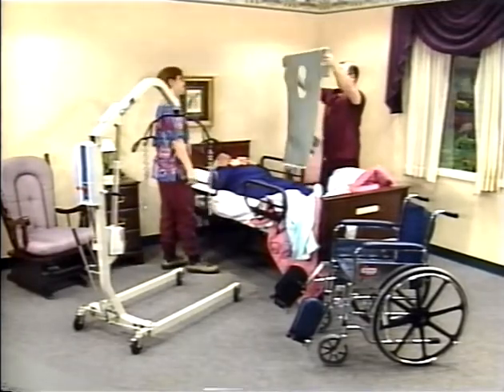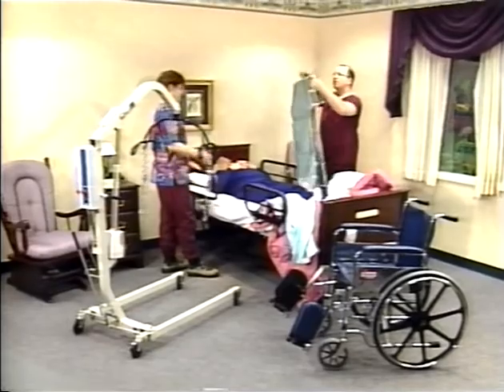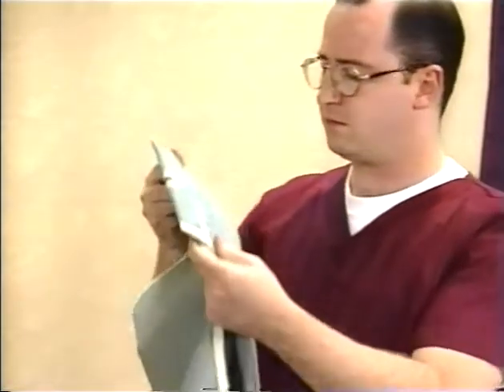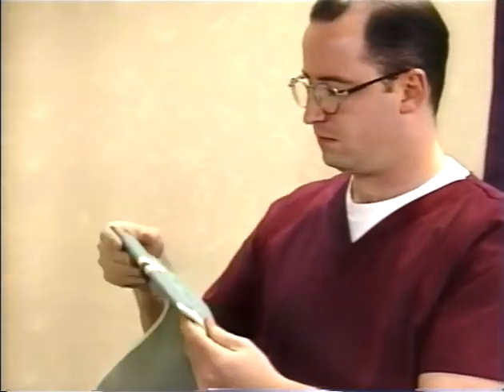Before you install the sling, it is very important to inspect it carefully for frayed or worn spots. Check the seams to be certain they are intact. Inspect slings regularly and follow the simple cleaning instructions to get maximum service from your slings.